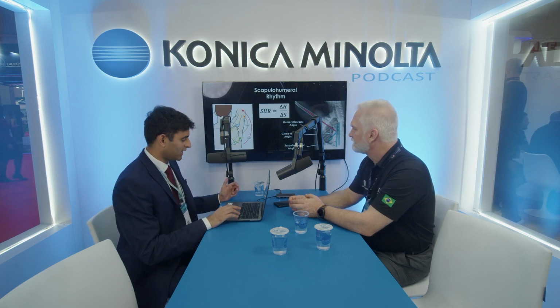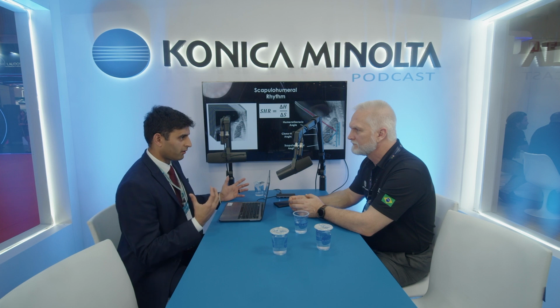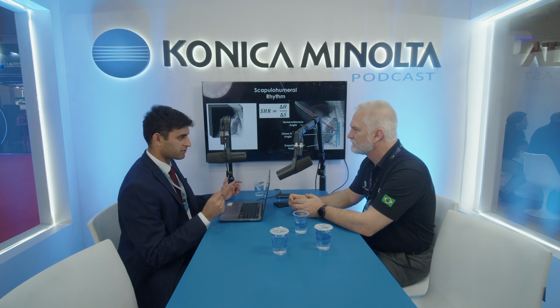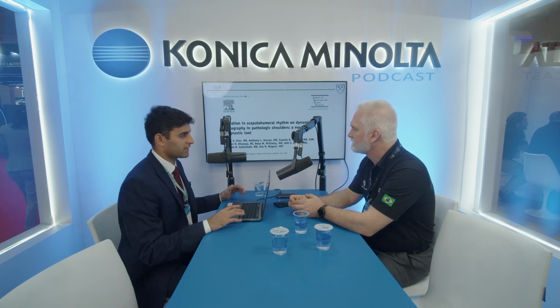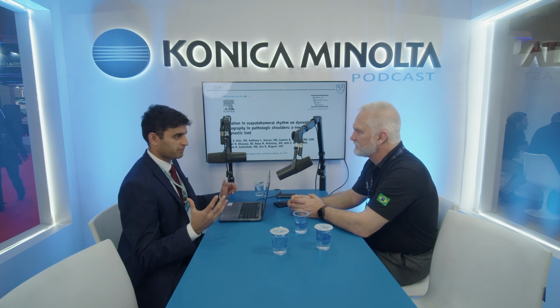Now, DDR is really allowing us to examine whether those classical narratives are holding true in normal patients, but also how they change when patients have shoulder problems. We have just published a study this year that investigated this, and how the scapulohumeral rhythm was different depending on the type of pathology.